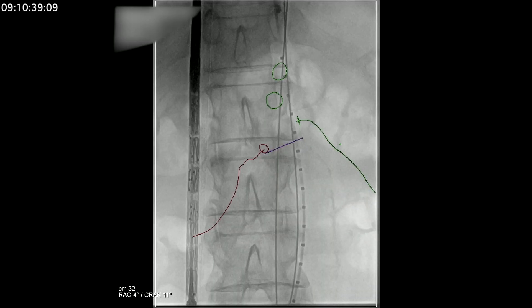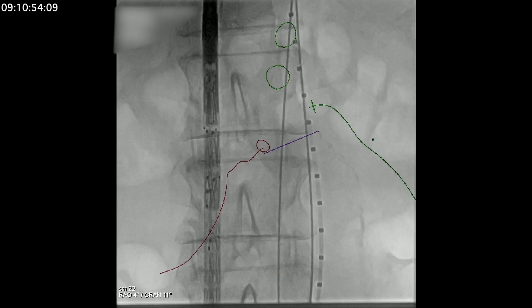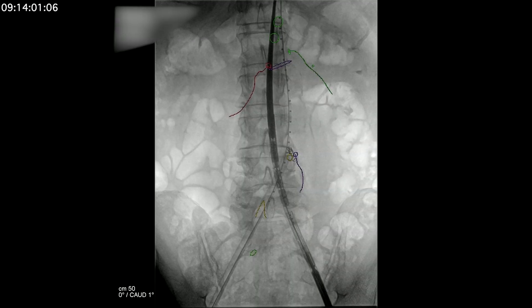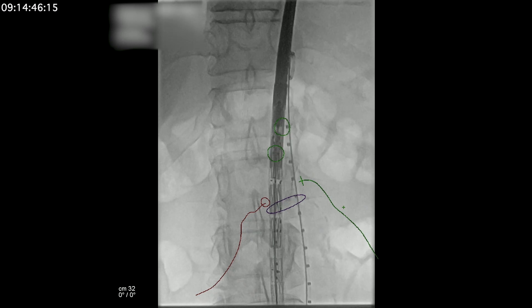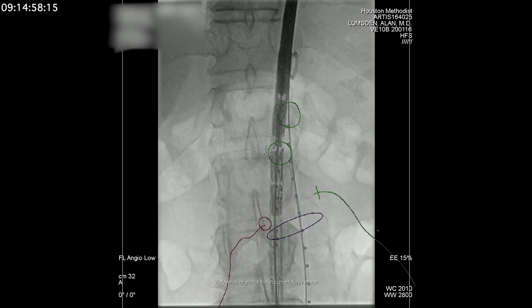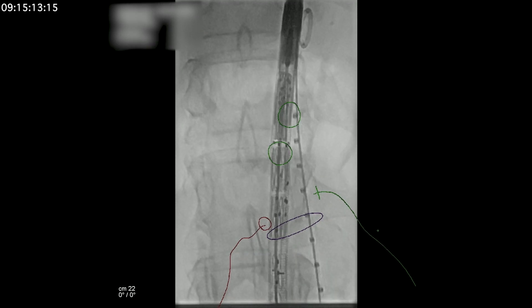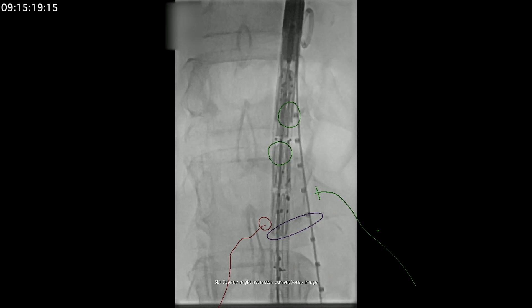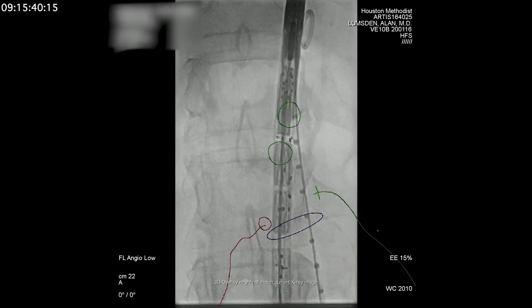We then went on to place the stent graft. You always start off by taking the fenestrated component and orienting it on the patient. Make sure you can identify the relevant renal fenestrations and the SMA. It's then delivered up over a 260 Amplatz Superstiff wire. The images are fused, and what we're doing is lining up the renal fenestrations by rotating the graft — sometimes you've got to advance it and retract it to get it completely aligned.